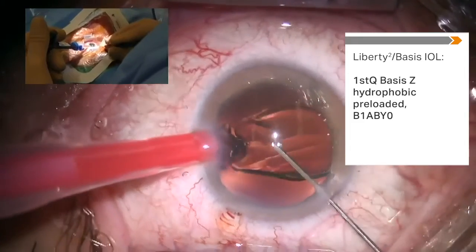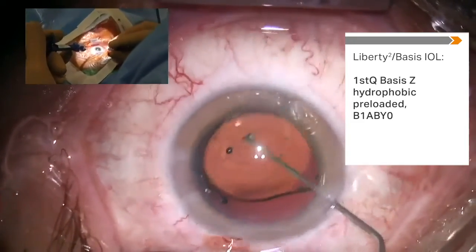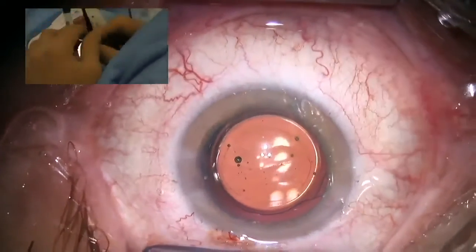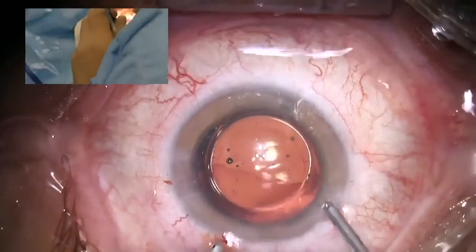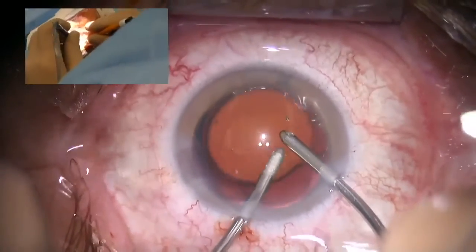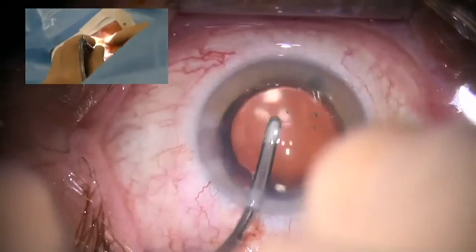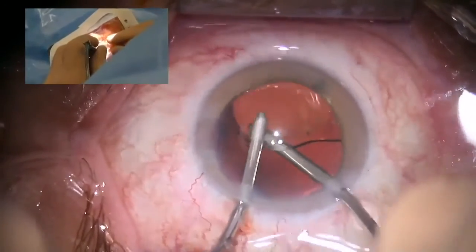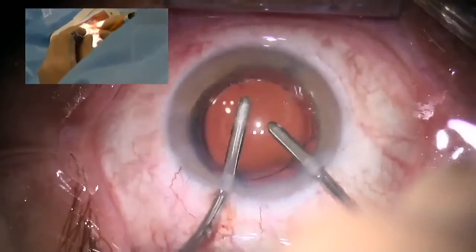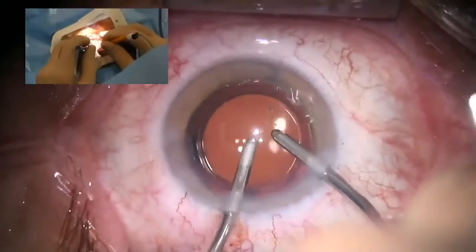But I think if you compare what you are saving in kind of energy dispersion in the eye, then it's always a very little time you waste. Waste is the wrong expression. It takes some minutes more, let's say. But only in hard cataracts.